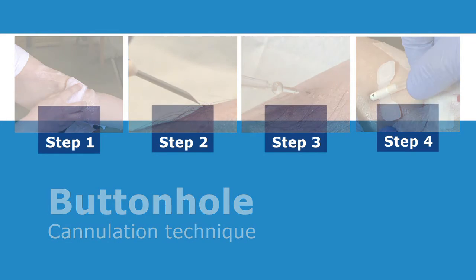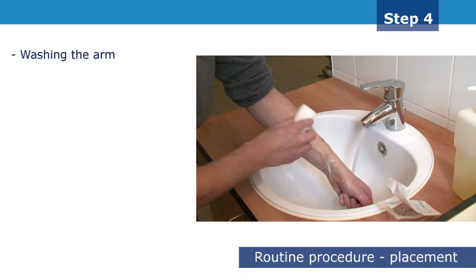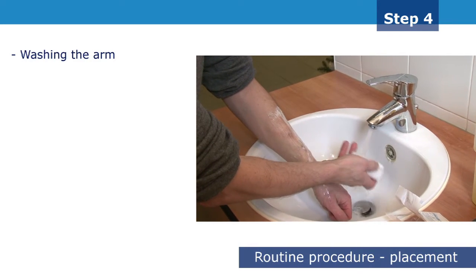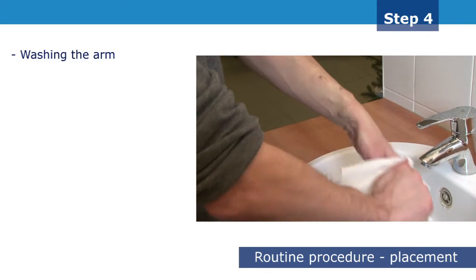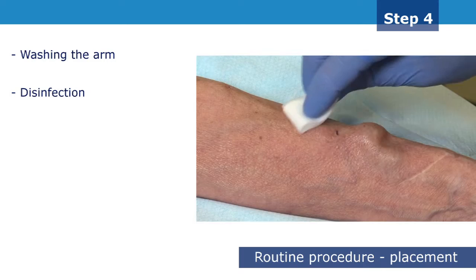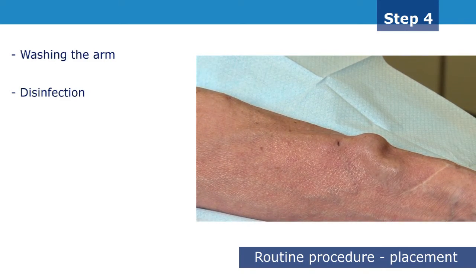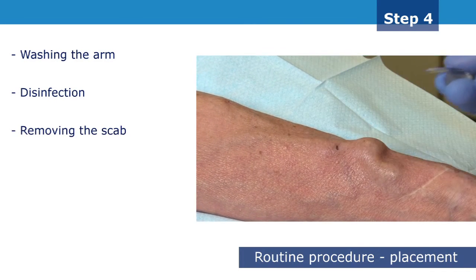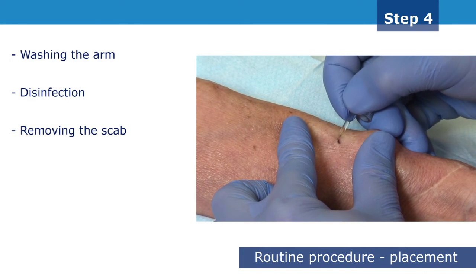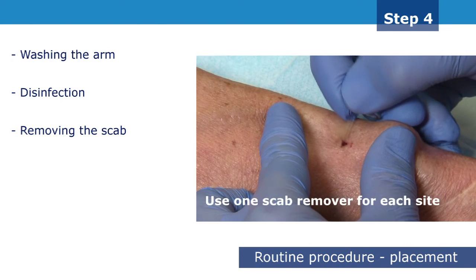From the seventh session onwards, the routine buttonhole puncture technique may be implemented. Wash and preferably scrub the cannulation sites with soap, then rinse and dry. After the first disinfection of the skin, any scabs over the cannulation sites need to be removed using the scab remover. Removing the scabs completely is essential in order to visualise the tunnel entrance and avoid infection. The previous scrubbing procedure will facilitate this process.